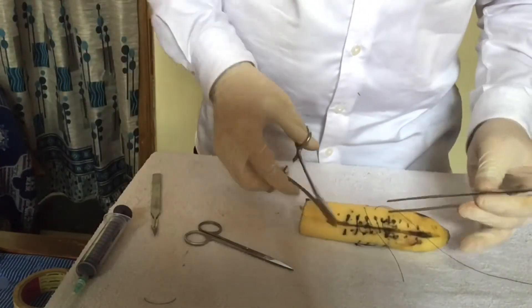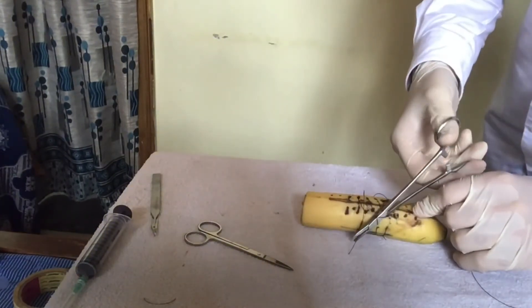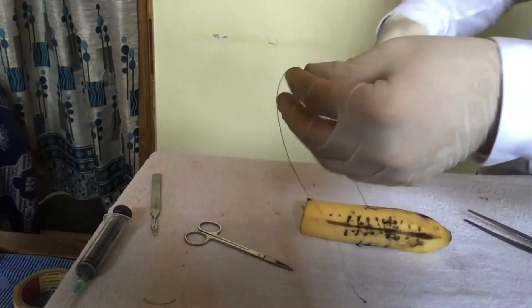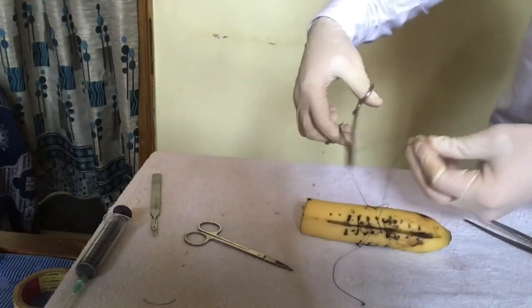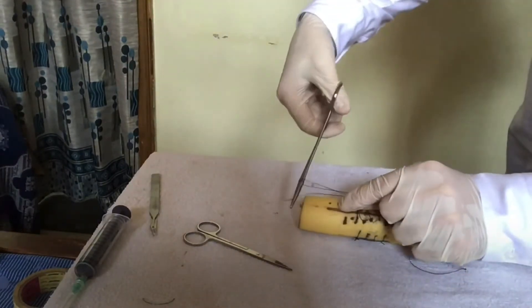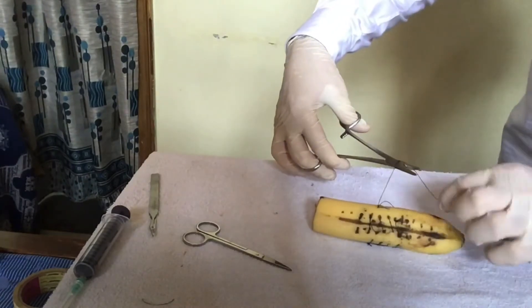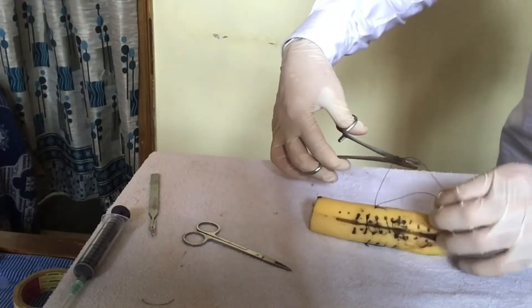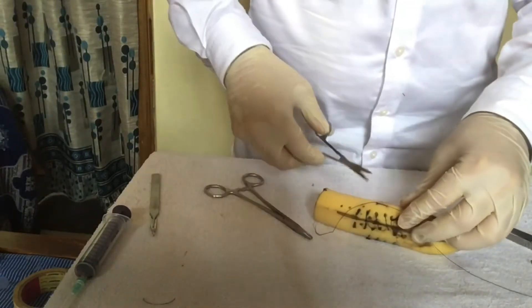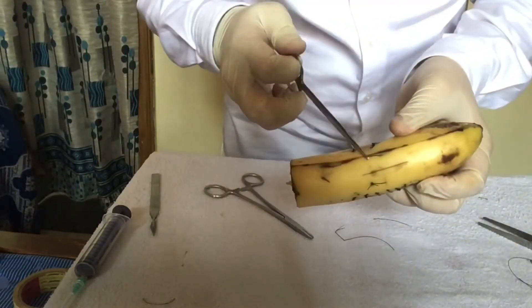The trick of tying the knot with the needle holder is very simple: when you loop around the needle holder away from yourself, you pull the short end towards you. When you loop the suture around the needle holder towards you, you keep the short end away from you. Now cut the extra suture — the horizontal mattress suture is done.